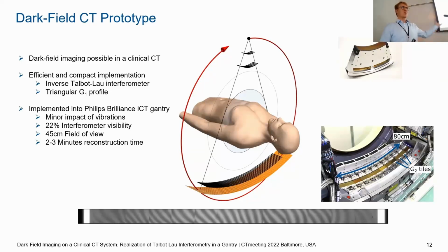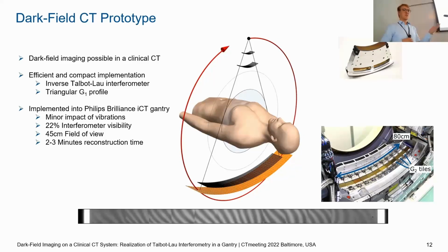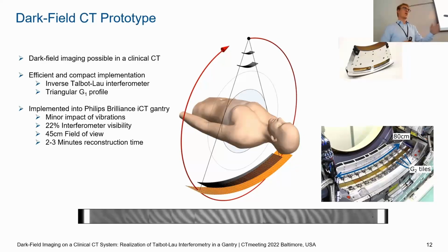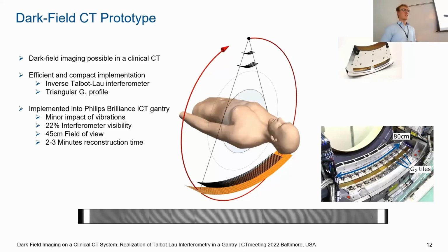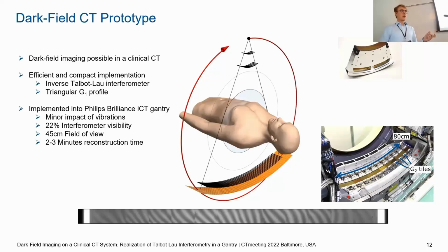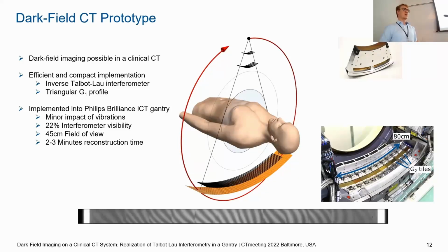It's not like going down to 0, but it degrades. With another triangular grating as a G1, we would get better visibilities there, but then the stopping power of the gold gratings would be smaller. So at the moment, 80 kV is the go-to value. And then the phase retrieval is done with a sliding window approach, which will be on our posters tomorrow in more detail.